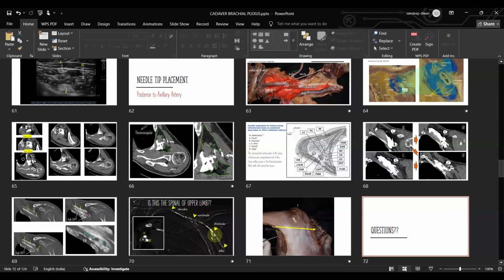Now, 15 ml of volume is good enough to conclude that beyond this, there won't be any drug percolating to the medial and the lateral cord. Then you keep on withdrawing the needle and inject separately at the lateral cord and the medial cord. That's what we do, Hetal. Yes, sir. Thank you, sir.